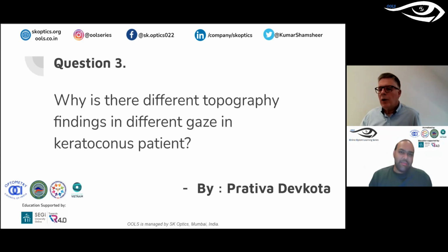And we're doing some work next weekend with the BCLA, and we are debating exactly that question. I've got a Placido-based topographer that I use for virtual contact lens fitting. But then, do I need a scleral profiler if I'm doing sclerals? Do I need an OCT to measure corneal thickness?